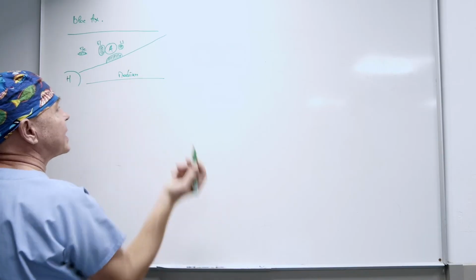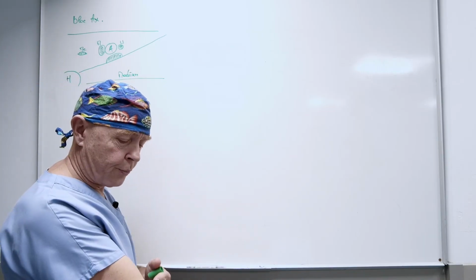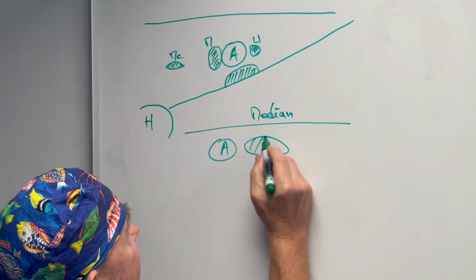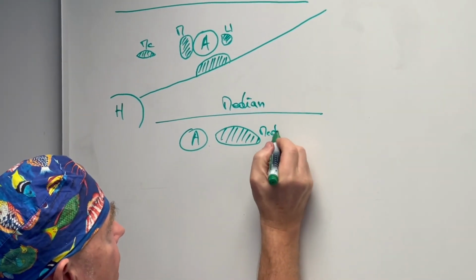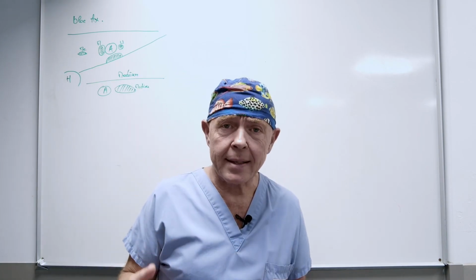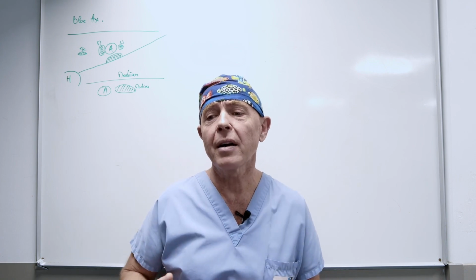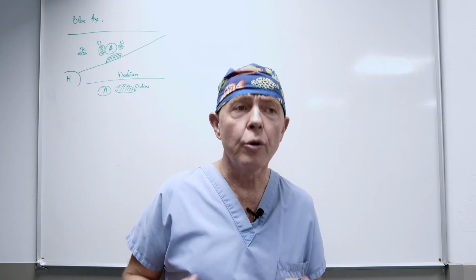It's quite straightforward. You position the probe approximately at the level of the elbow crease, and the primary landmark will be the artery. And the median nerve is nearly always adjacent to its artery at that particular level. Thus, you see, truly it's something quite straightforward. There's no necessity to learn all the muscles and every detail at the very outset, as that will probably lead to confusion and hinder you from progressing to practice and commencing.